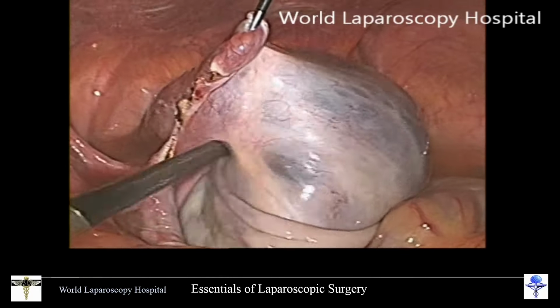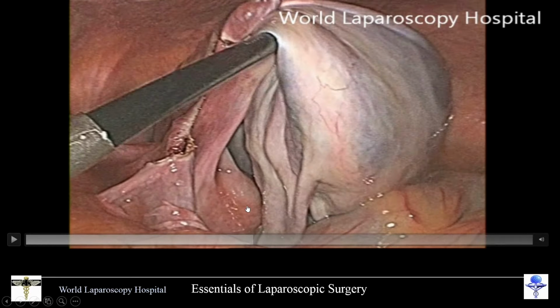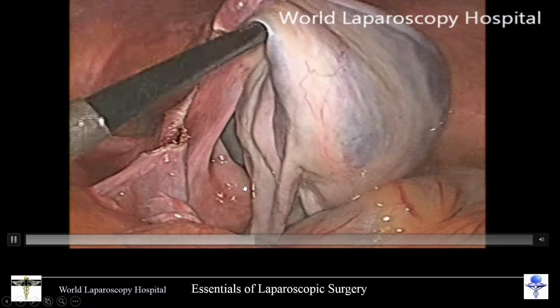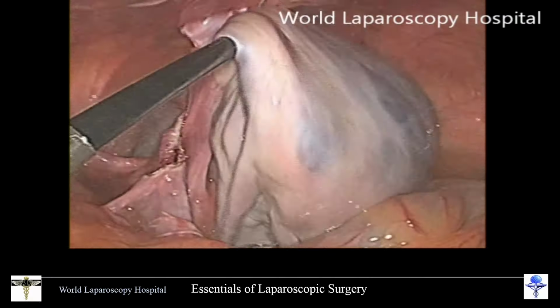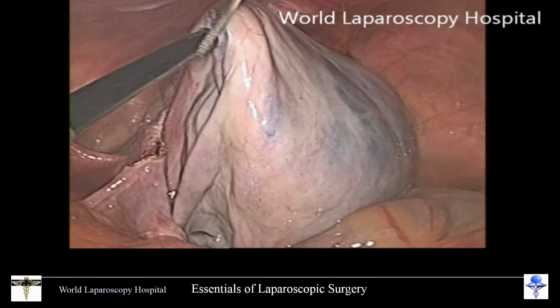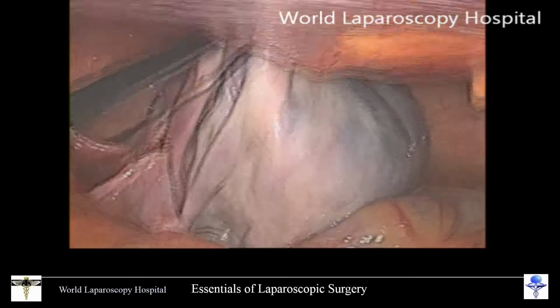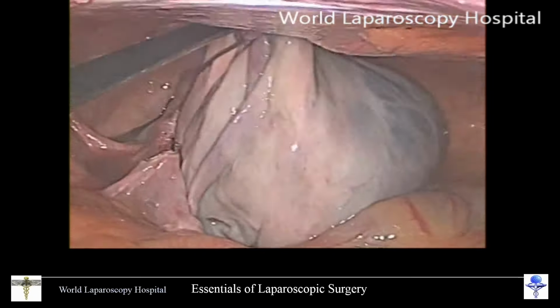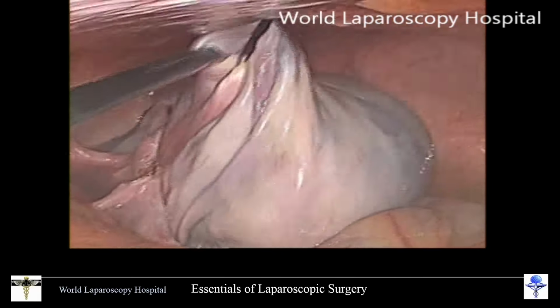Medial traction is important because the ureter will cross below. This is the uterus, and this is the ovarian ligament, and here is the tube. So, the uterus is small, already atrophic. You can rearrange the grasper or Storz mini alligator so that the proper traction can be given, and then you can start again separating it.